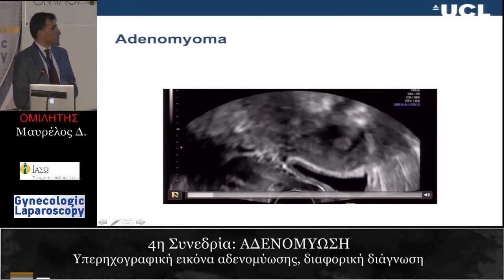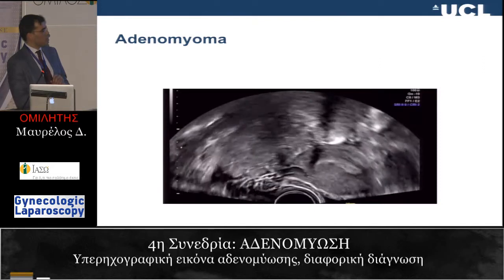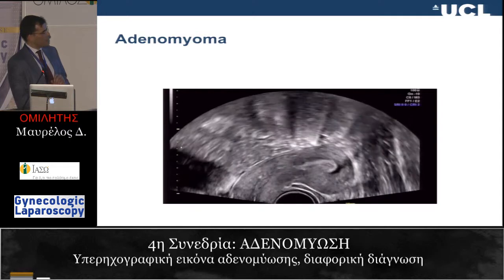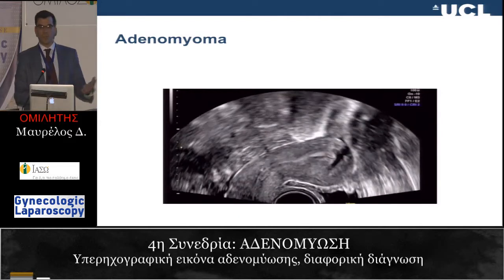Let's see. So there's the uterus, that's the endometrium there. It looks normal posteriorly, normal anteriorly mostly, but there is a distinct area here, which is an adenomyoma. It's important to be able to make that distinction, because if you think this is a fibroid, then you book the woman for a transcervical resection, and you'll find something different, and you'll be in trouble. There will be no capsule, the disease will be diffuse, and there'll be nothing to resect. And so you'll have some egg on your face trying to explain why you booked this hysteroscopy.